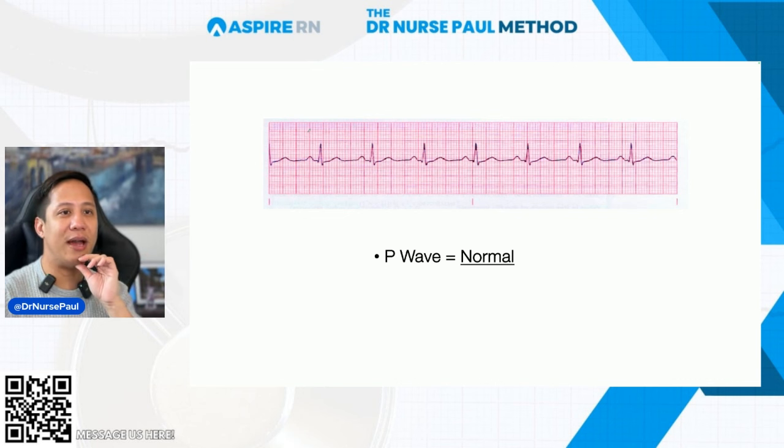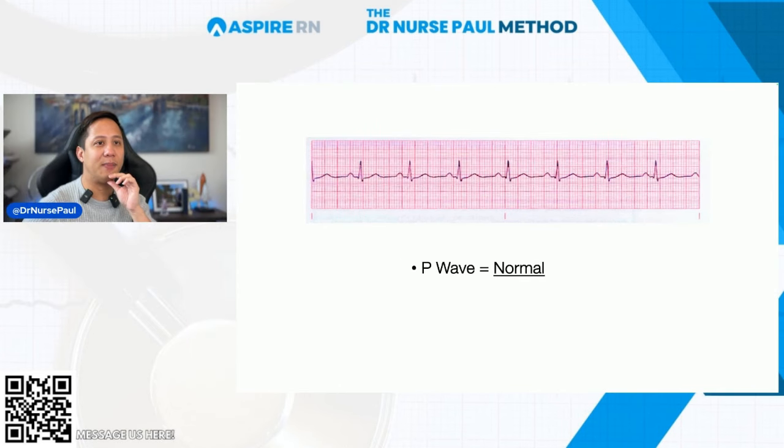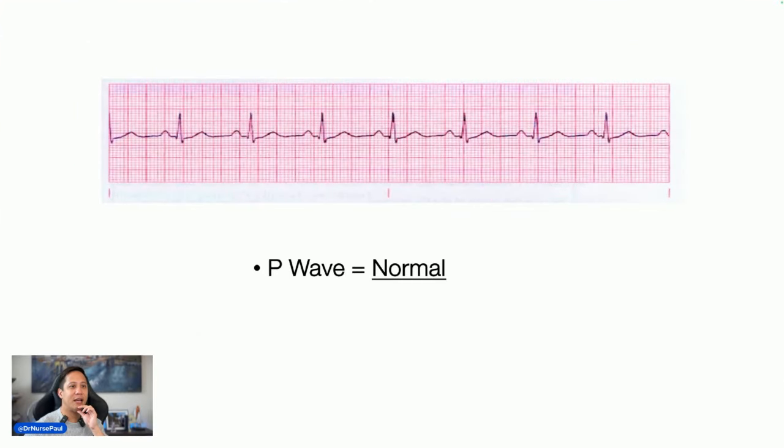Maximize your screen if you have to. Probably let's do this. How about we increase the screen bigger, bigger, bigger? How about that? Is that better? For those watching the live stream, because I think earlier was a little smaller. P wave is normal, right?